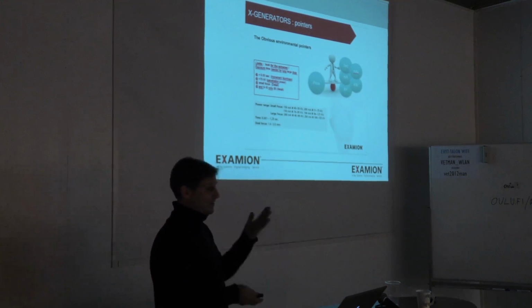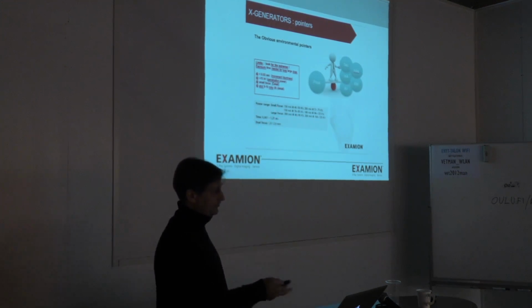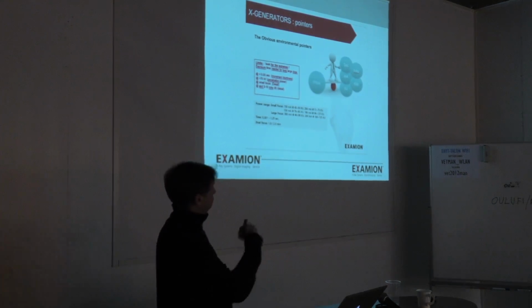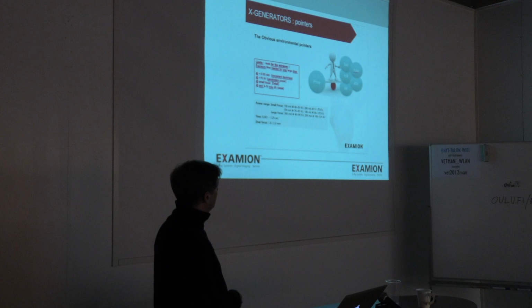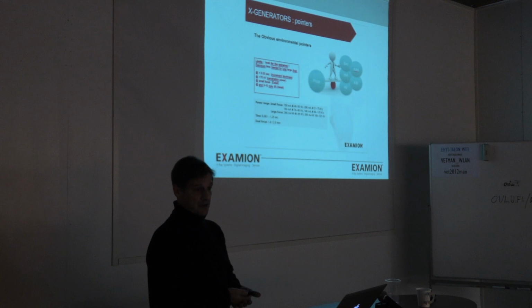Again, a balance. Now, to find out how that machine reacts and from which value it jumps to a larger focus, some of them do that from a very low kilovolt, for example, others from a higher kilovolt. It's very difficult to know. And sometimes you actually have to measure it because it cannot be found on paper.